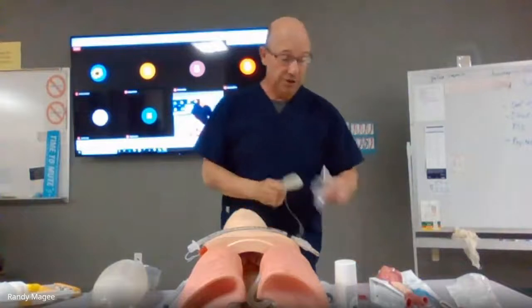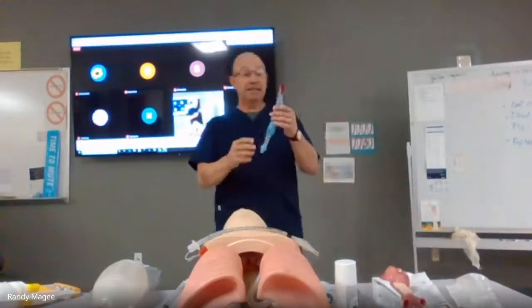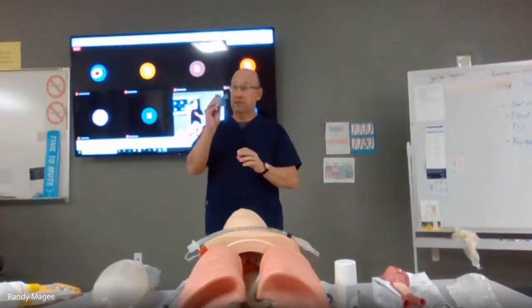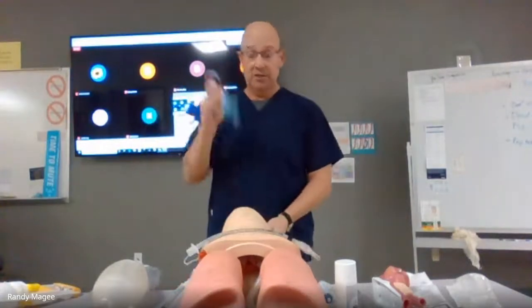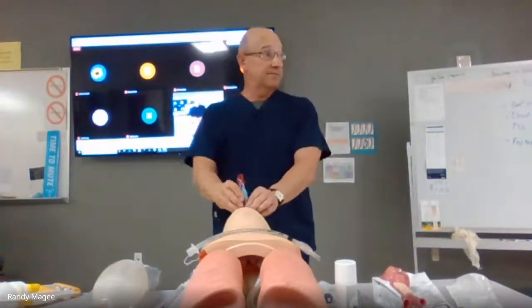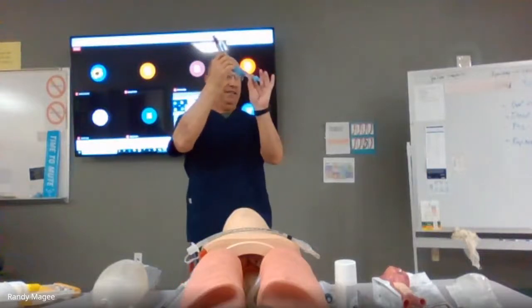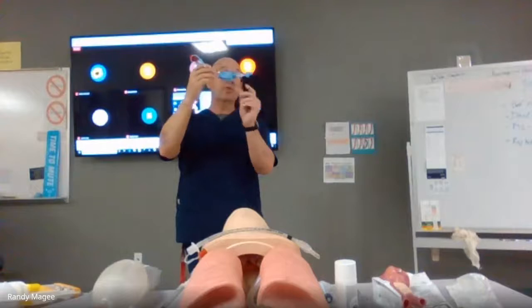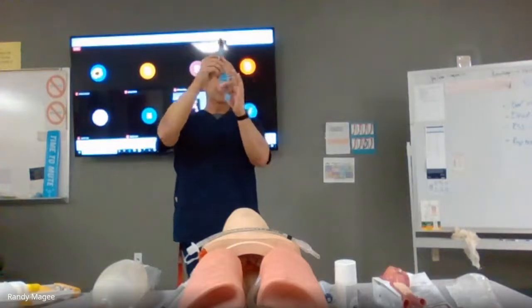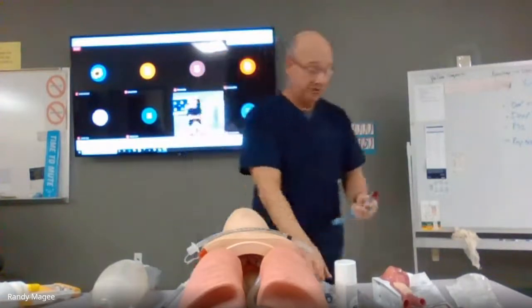Okay. There's another rescue airway called the King Airway, and this is really a BLS airway. I think they're going more towards basic life support with this. And again, this is actually a very good airway. You just get head tilt, chin lift, and again, just shove it down in there, okay? Put 30 cc's of air in, okay? So this is either going into the esophagus or the trachea. If it goes into the esophagus, no problem, because this balloon is going to inflate and block off the esophagus, and then this has ventilation ports here, because this part is going to sit over the airway. So it's a very good airway.